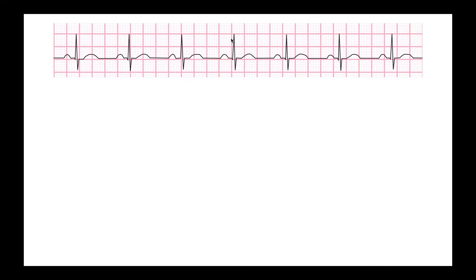So here's my EKG pattern. Regardless of your clinical interpretation, to calculate heart rate we need to know if it's regular or irregular in rhythm. For that we look at these RR intervals, basically the distance between this peak and this peak, then this peak and this peak. If all those distances are roughly the same then we can call it regular. This RR distance is roughly the same as this one, which is roughly the same as this one. So this would be a regular rhythm.